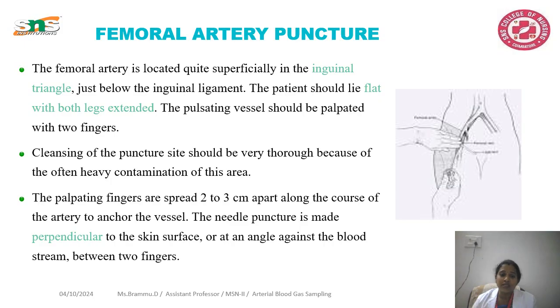Here, around 2 to 3 centimeters while palpating the artery, the needle is punctured perpendicular to the skin, at a 90-degree angle, and the needle is placed and inserted in between both the fingers.